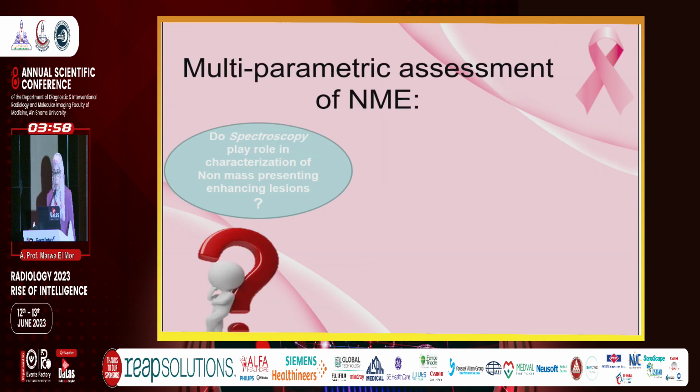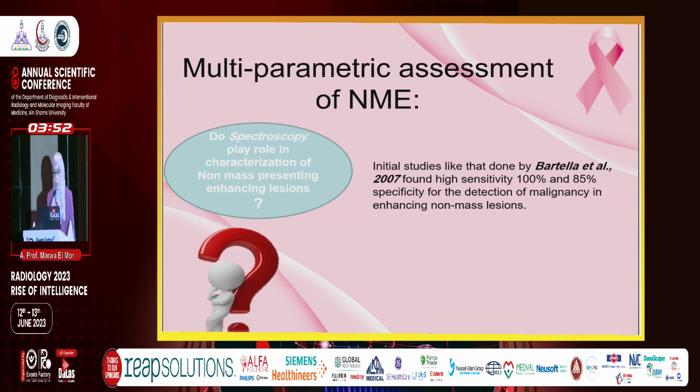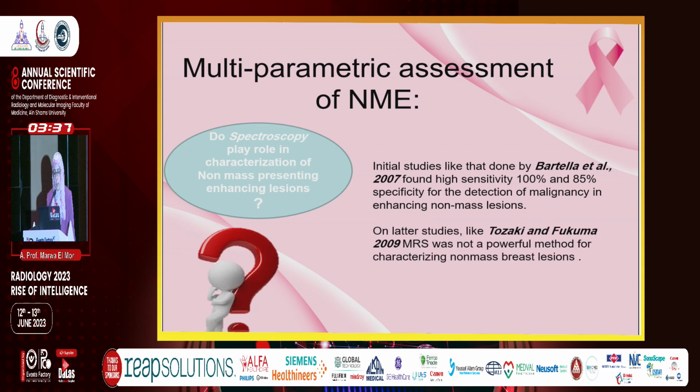Does spectroscopy play a role in characterizing non-mass enhancing lesions? Initial studies, like that done by Bartella et al. in 2007, found a high sensitivity approaching 100% and 85% specificity for the detection of malignancy in enhancing non-mass lesions.